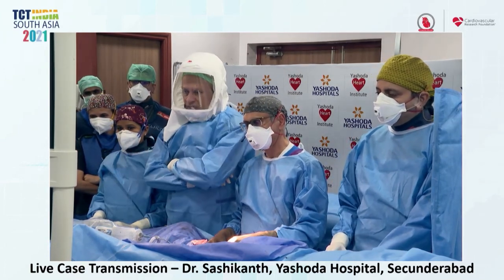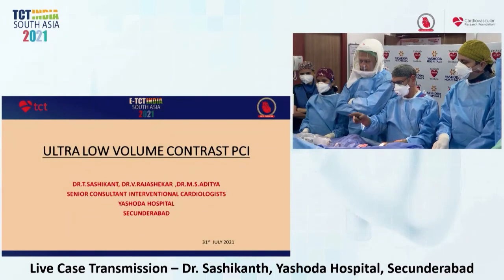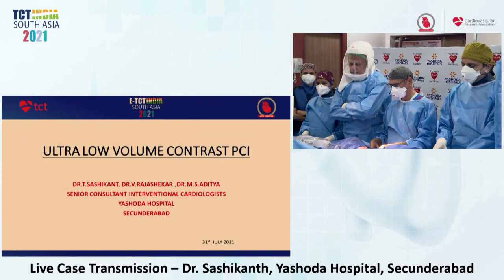My team, Devi's sister, Kishore, Naveen, and Chiranjeevi are here to help us with the IVUS imaging. Today we have a case which we are going to present. Can we have the first slide, please? Should we go to the next slide?